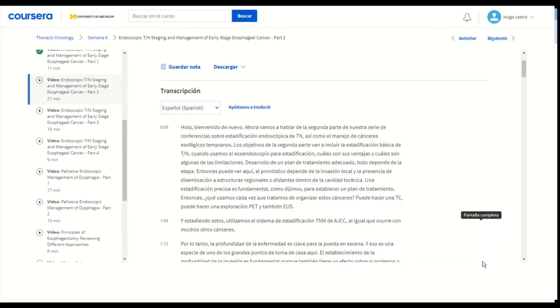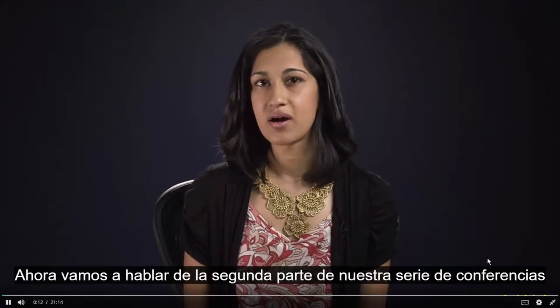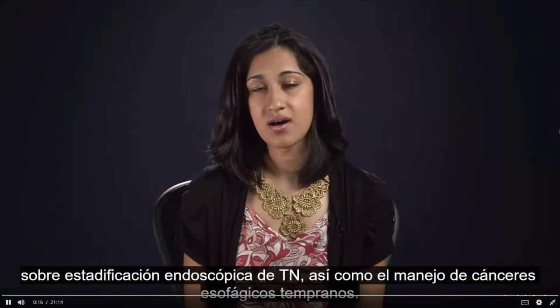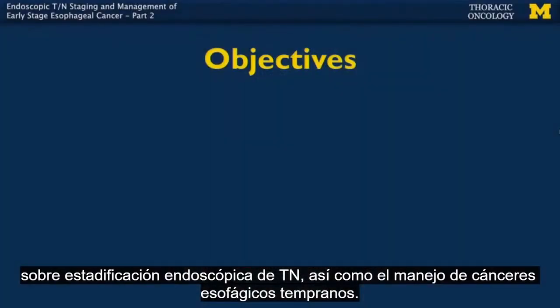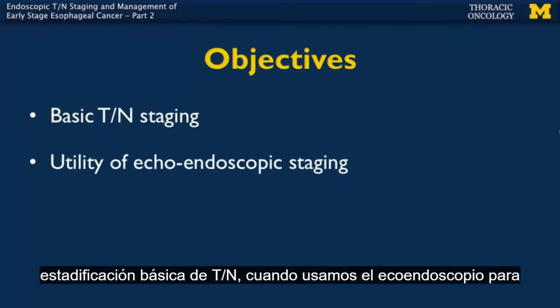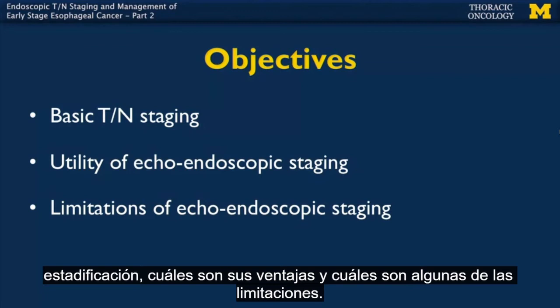Hello, welcome back. We're going to now talk about part 2 of our lecture series on endoscopic TN staging as well as management of early esophageal cancers. The objectives for part 2 are going to include basic TN staging, when we use the echo endoscope for staging, what are its pros and what are some of the limitations.